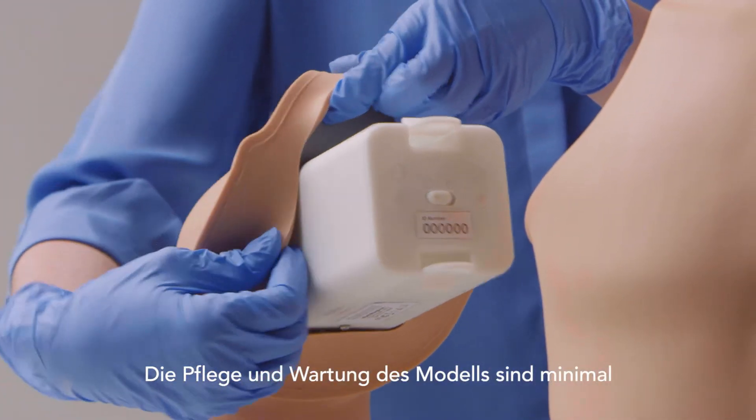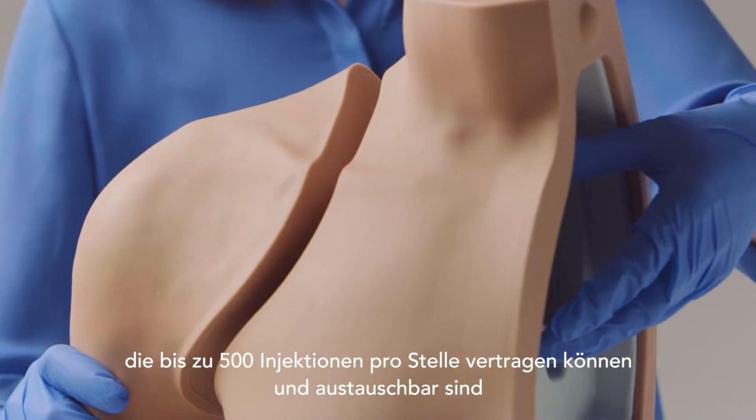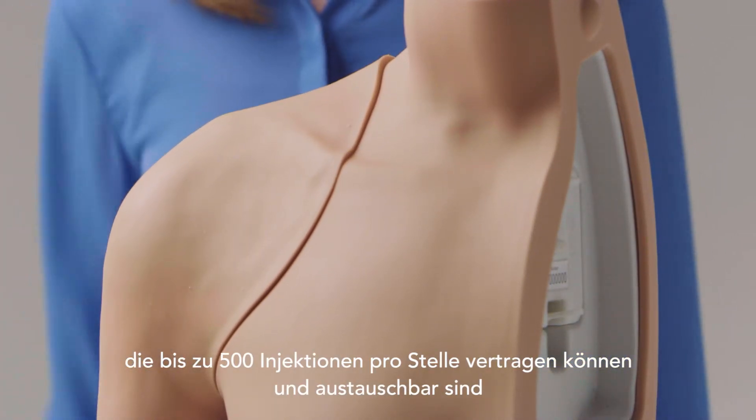Care and maintenance of the model is minimal. Each model comes with two skins, which can withstand up to 500 injections per site and are replaceable.